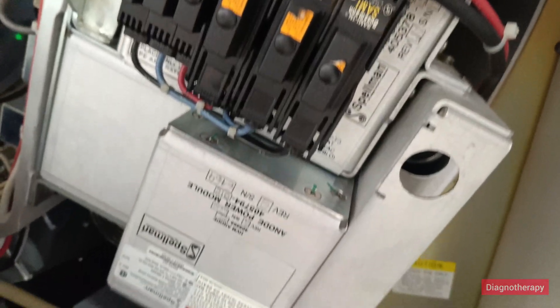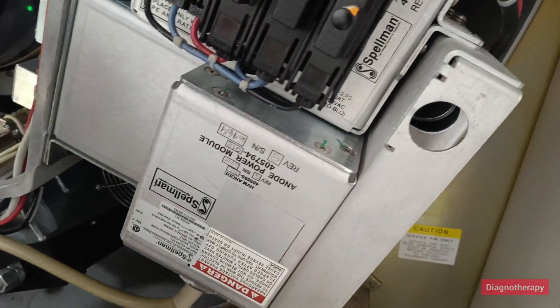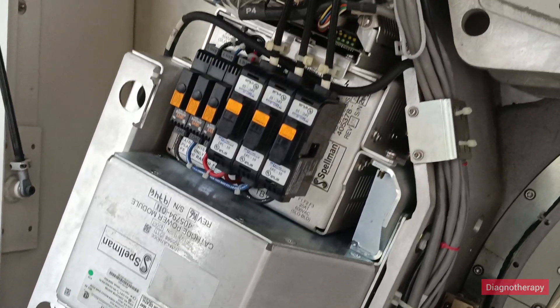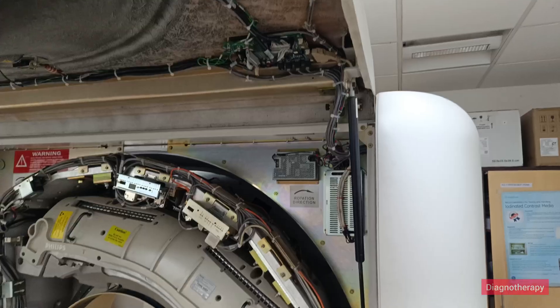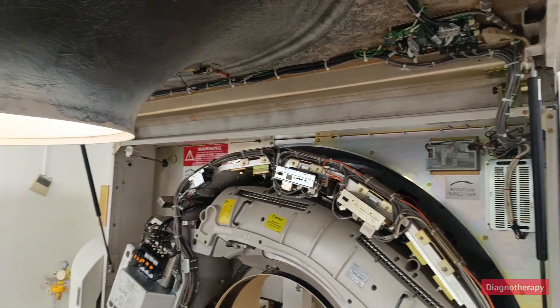From the x-ray tube, the anode part goes into this tank. Moving to the other side, we have the cathode tank. There are hydraulics placed which help in keeping the gantry open.